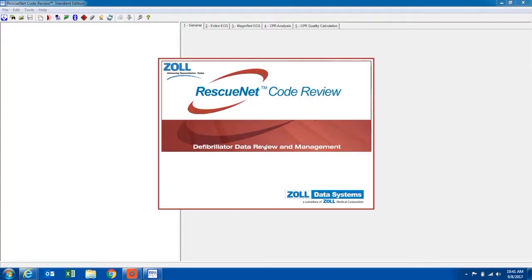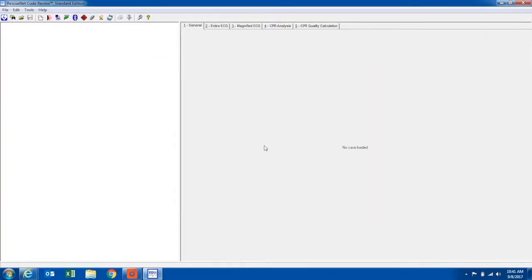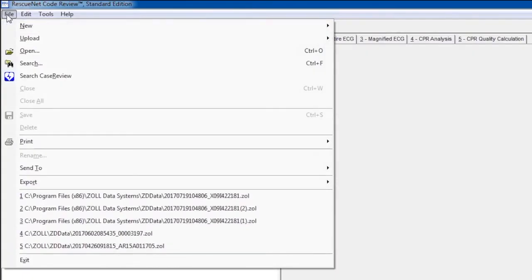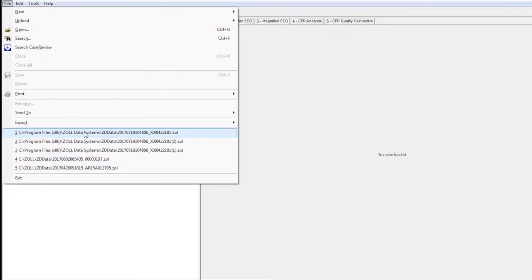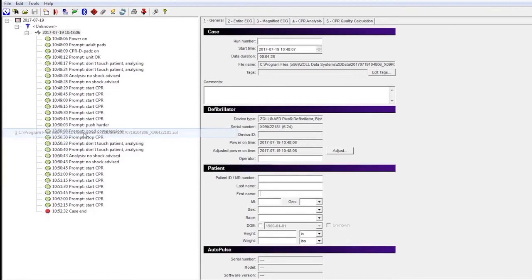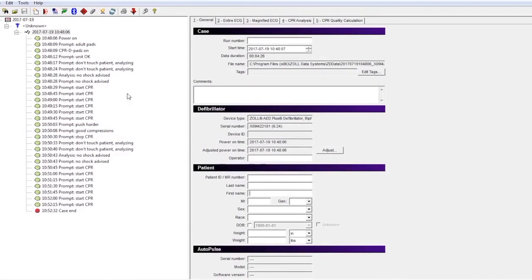You can also export case data to Xole code review by simply uploading case data to a USB drive. Once uploaded, insert the drive into a USB port on a laptop with code review loaded on it. Open code review, locate the file on your USB drive, and open it in code review. Xole code review can be downloaded at no charge.